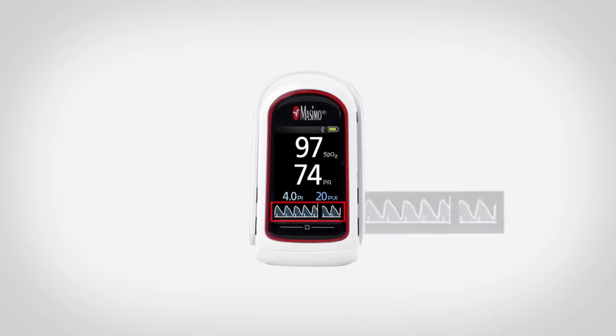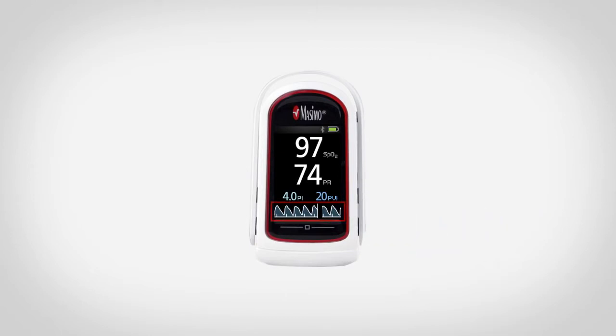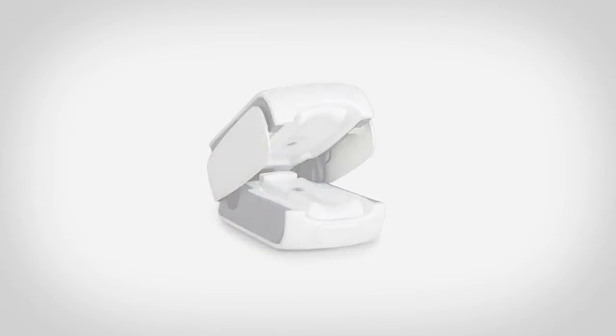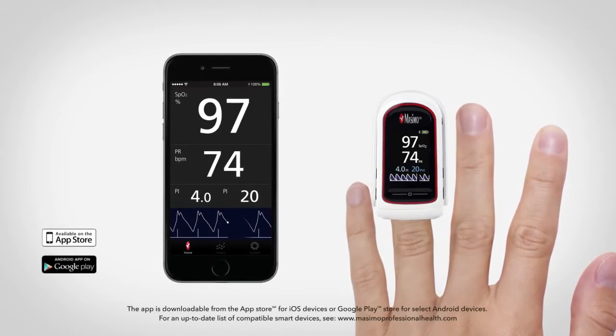MightySatRx is designed for performance, featuring a plethysmographic waveform, a high-resolution display with a rotating and adjustable color screen, a unique silicone finger grip for secure placement and enhanced comfort, and a free downloadable Masimo Professional Health app with trend and sharing capabilities.